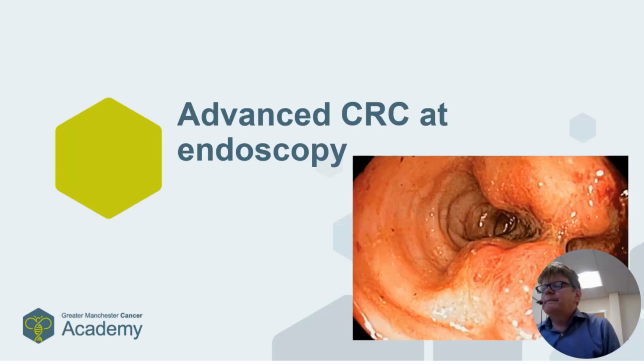Here is a picture of a typical colon cancer endoscopy. It is usually pretty obvious when we see it. We're all familiar with it. We'll all recognize that that is a cancer. And what I'll talk about now is how we know that.